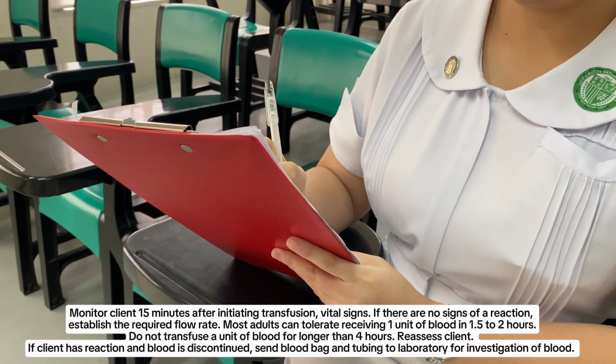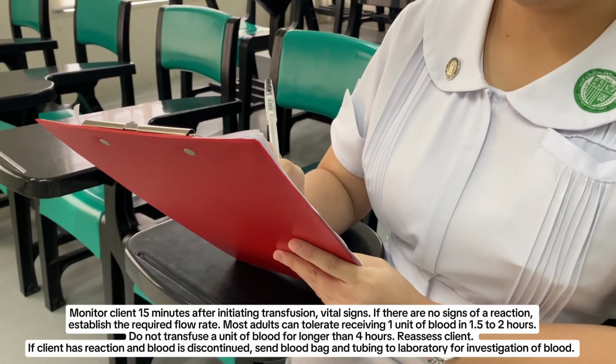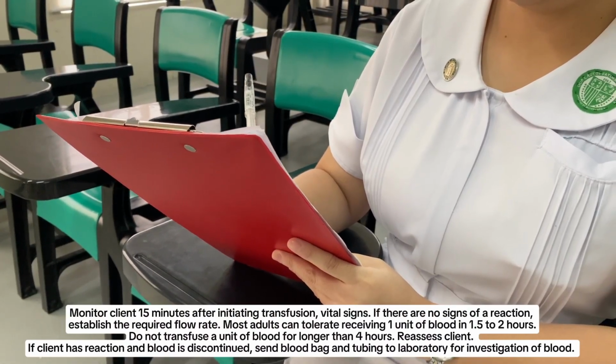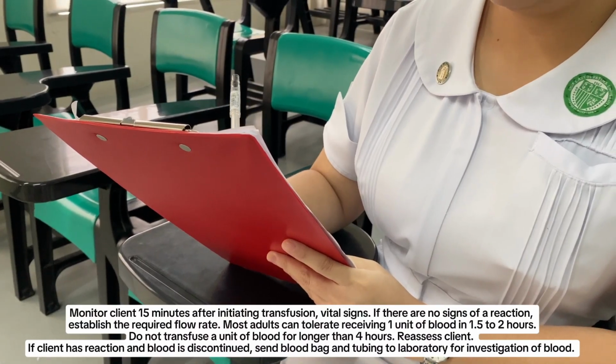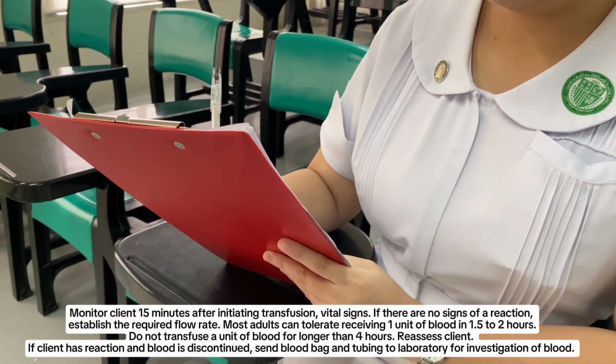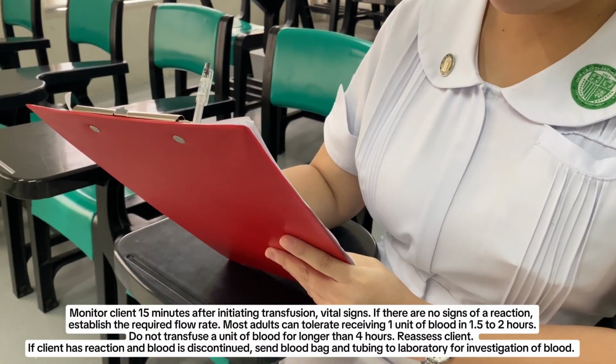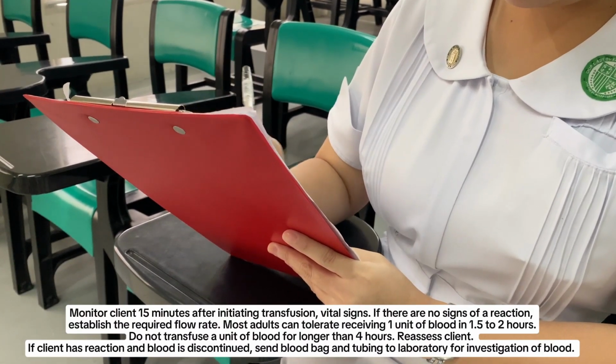Most adults can tolerate receiving 1 unit of blood in 1.5 to 2 hours. Do not transfuse a unit of blood for longer than 4 hours. Reassess client. If client has reaction and blood is discontinued, send blood bag and tubing to laboratory for investigation of blood.